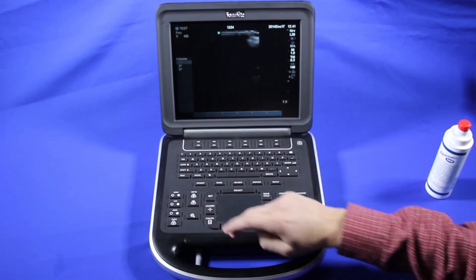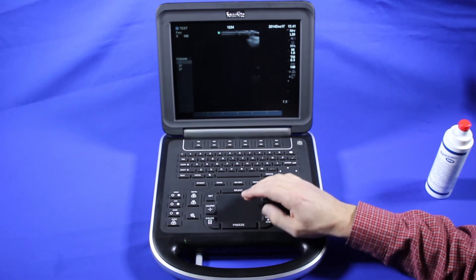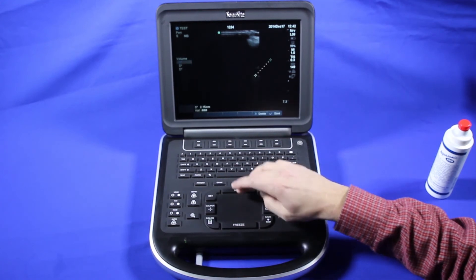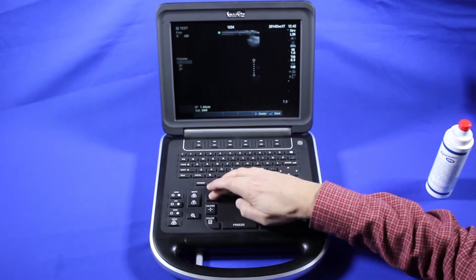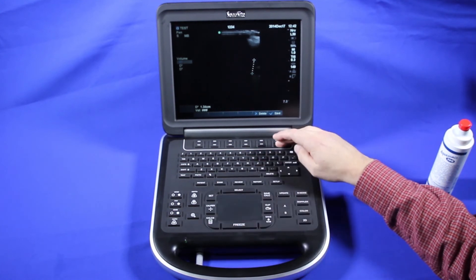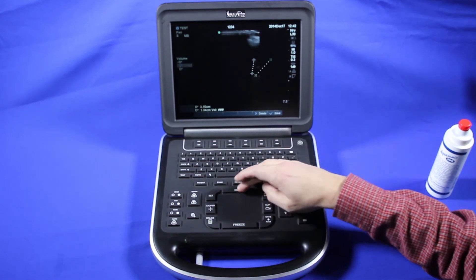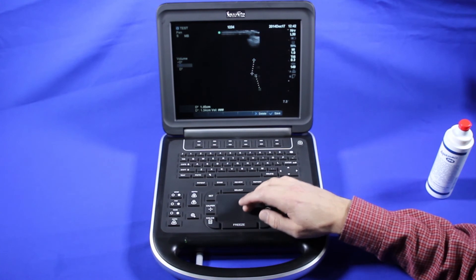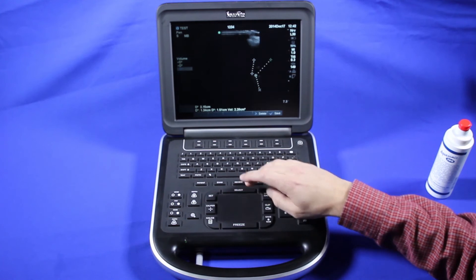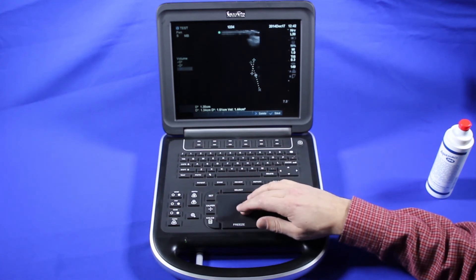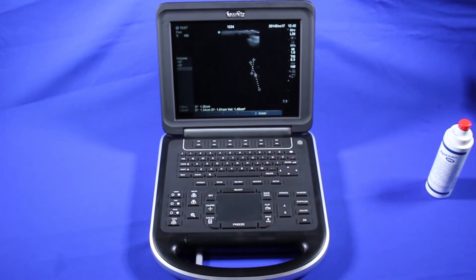I'm in a nerve setting, so if I hit calcs, basically what's available is the volume. I can hit distance 1 and select that — it's going to allow me to take the first distance. Hit set, hit save. Take distance 2, select, hit save. Distance 3, select, and hit save. And I have my volume.